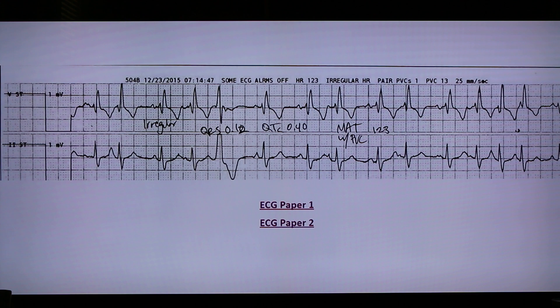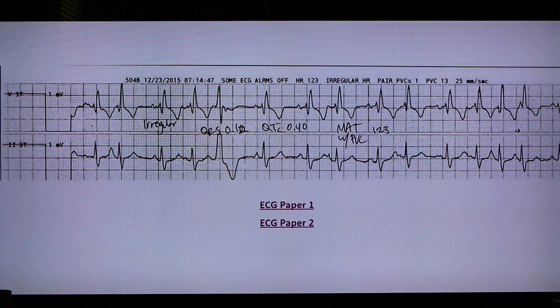A good telemetry strip printout should have the telemetry box or monitor ID number printed on it. This will help bedside nurses check if the patients are in the right telemetry boxes.